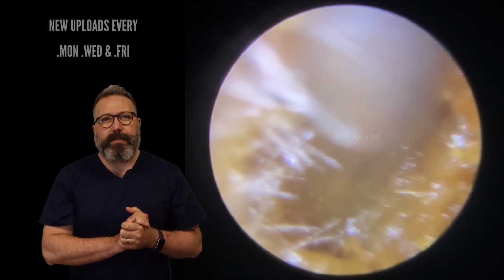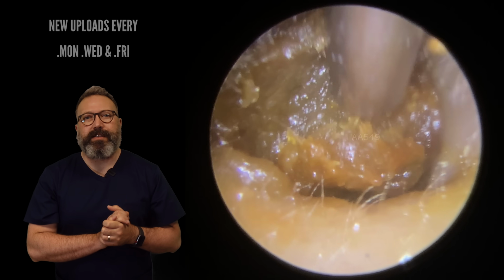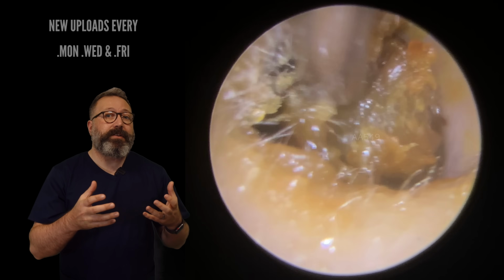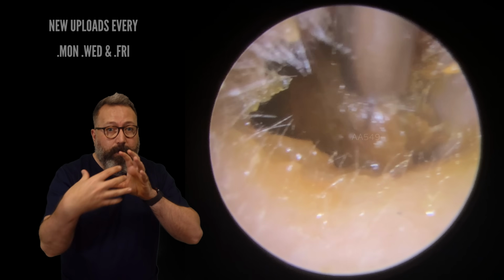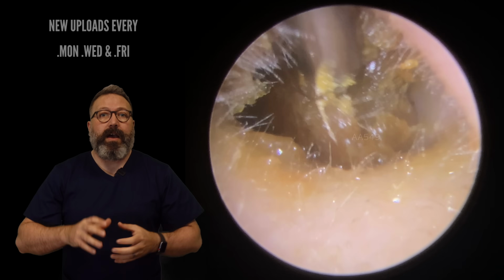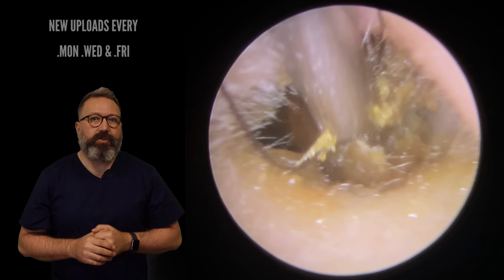There we are. Let's get a grip on this next section. Trying to draw this forwards, but it's now wedged. We've spun it and it's actually got stuck. As we pulled that last little bit of skin, it turned the wax, but we can see here that the depth of the wax there and the length of the wax, if you like, doesn't allow it to turn. And we're going to hit this kind of block just there, and it's not going to budge from that point.